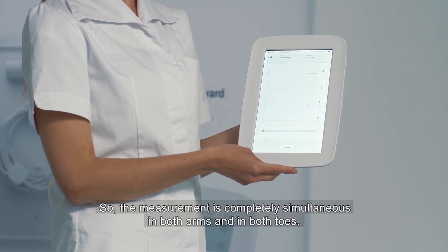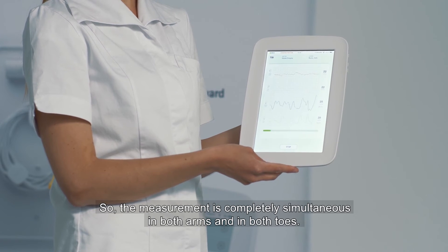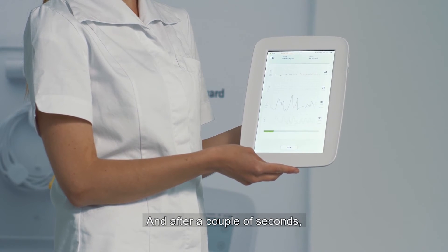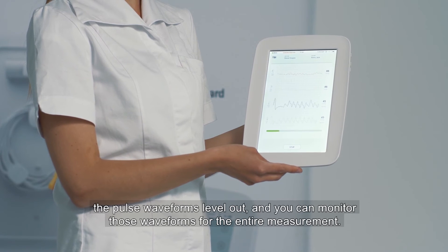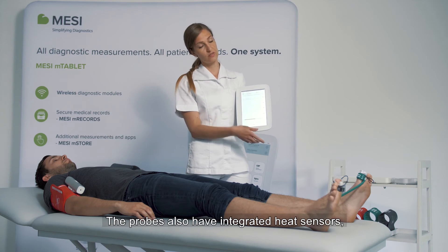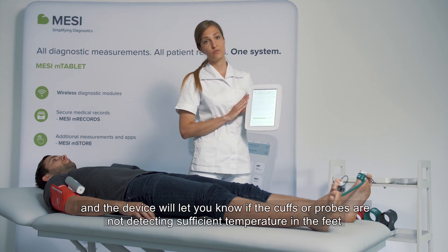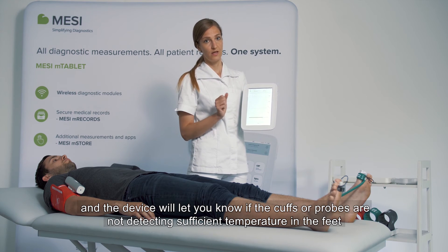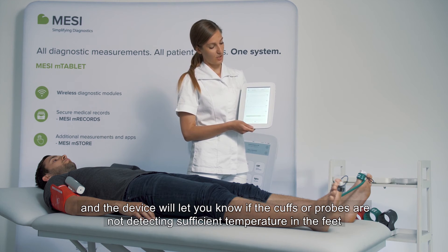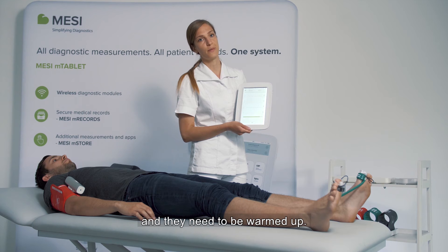The measurement is completely simultaneous in both arms and in both toes. After a couple of seconds the pulse waveforms level out and you can monitor the pulse waveforms for the entire measurement. The probes also have integrated heat sensors and the device will let you know if the cuffs or probes are not detecting sufficient temperature in the feet and they need to be warmed up.